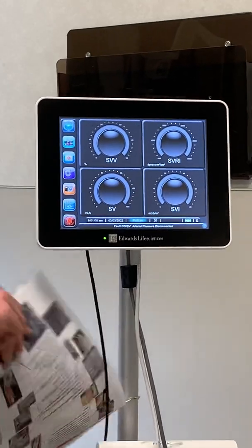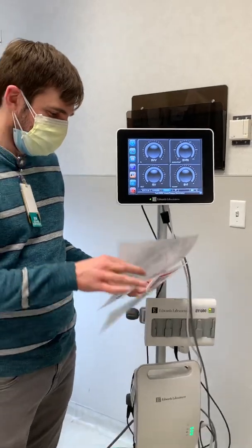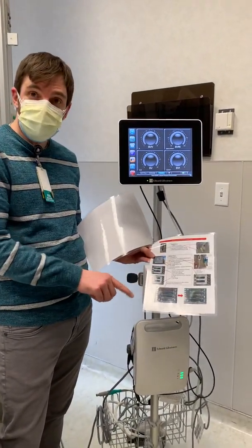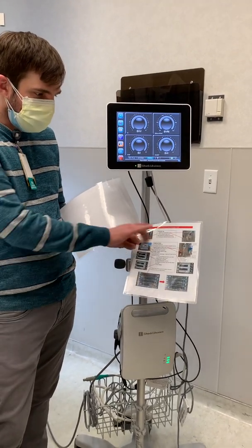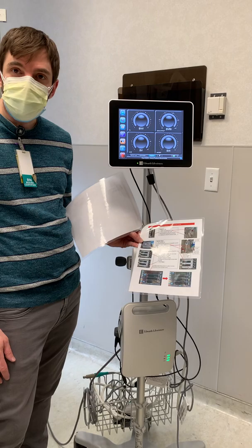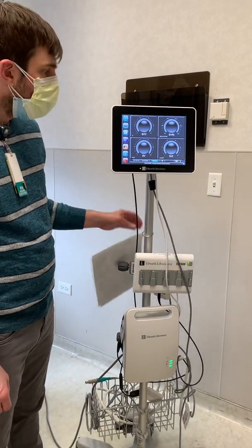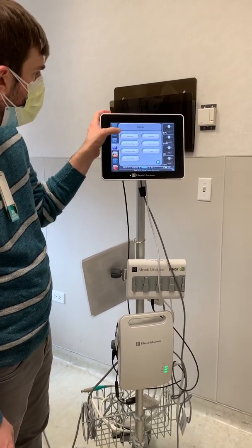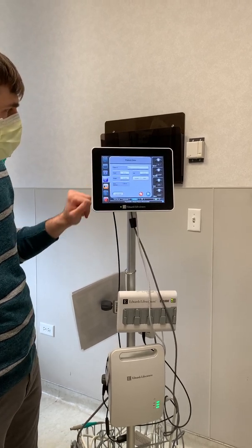No mystery here. If you forget, there are also laminated instructions with pictures right here connected to the machine — step-by-step, very clear instructions. Can you update weights on it? That's a great question. Go to patient data in the settings and you can change the weight. You can even do a new patient.